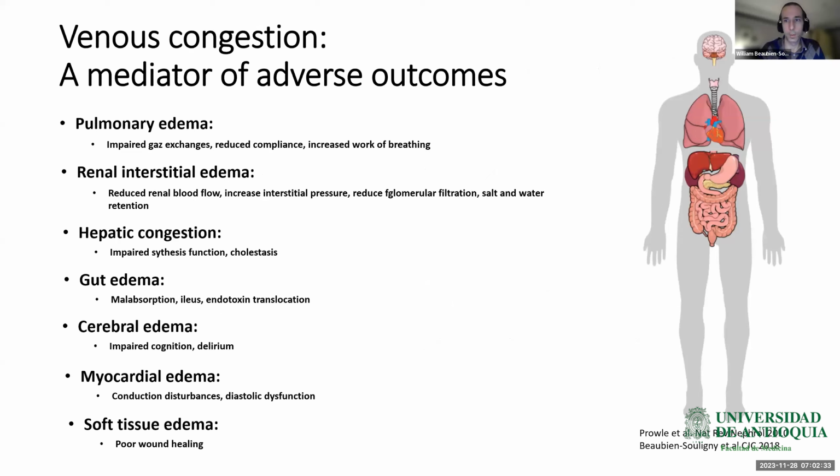And so when you go to other sites, for example, the portal vein, which is a very easy site to assess using point-of-care ultrasound, you can see here on the screen a normal portal vein, with minimal portal flow pulsatility and a continuous pattern during the cardiac cycle. And as venous congestion develops, the variations in venous pressure are transmitted to the portal system, and we see the appearance of portal flow pulsatility, which is shown on screen. Usually when the difference between the maximum and the minimal velocities during the cardiac cycle is greater than 50%, we consider this to be clinically significant.